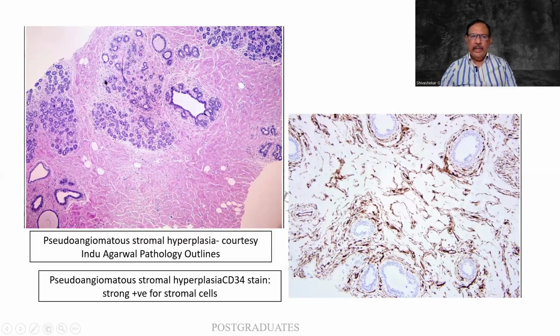So I find that there is a marked proliferation of the glandular element, and there is a ductule over here. Maybe some kind of an apocrine metaplasia is seen with inspissated secretions. But more prominent will be the marked desmoplastic stroma that is there. Otherwise, I will end up giving a diagnosis of fibrocystic disease with a hyperplasia alone, without atypia.